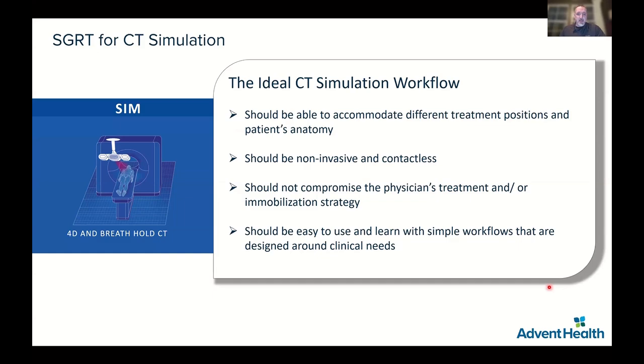That it should be able to accommodate different treatment positions and patient anatomies. That seems to make sense. Should be non-invasive and contactless. This has been even more emphasized with the COVID issues that we've had back in 2020. It should not compromise the physician's treatment and/or immobilization strategy, which is somewhat common with other solutions. And then it should be easy to use and learn, with simple workflows that are designed around a clinical process, not around a software development process.